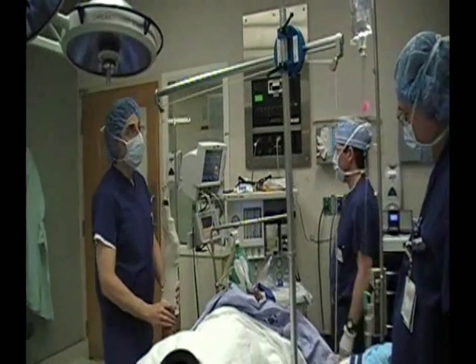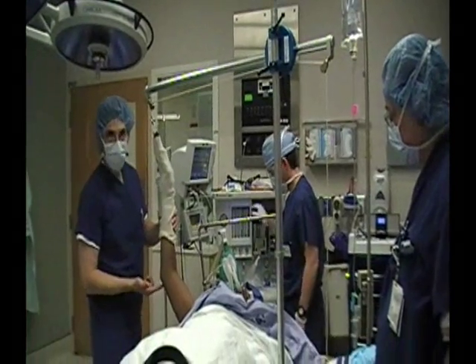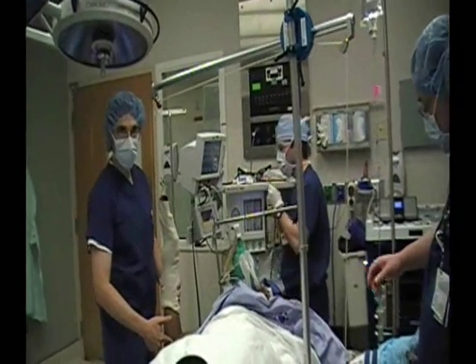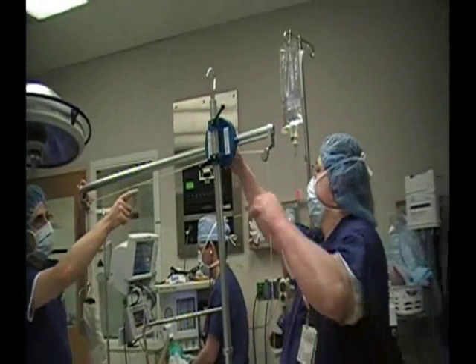I'm going to get a little bit posteriorly. I'm going to get a little bit anteriorly as well. And I'll pull this back right here just so we can cut off.